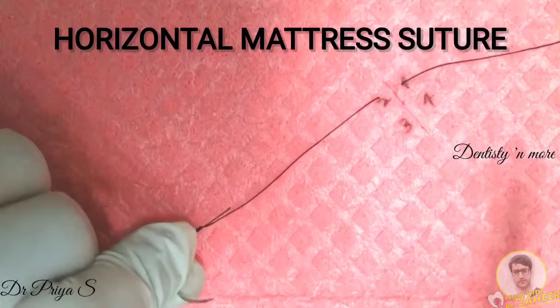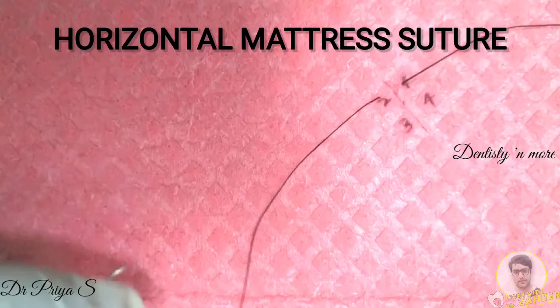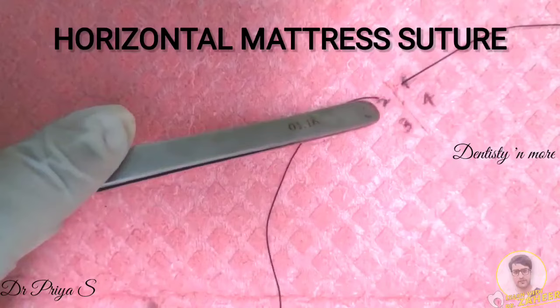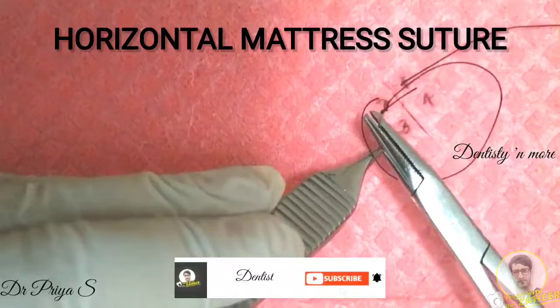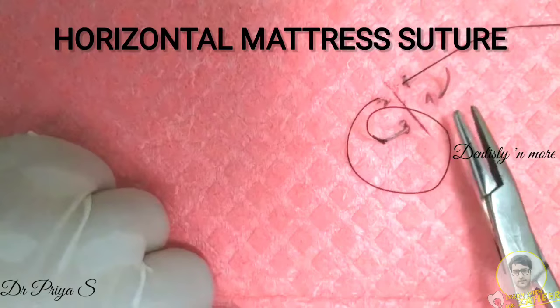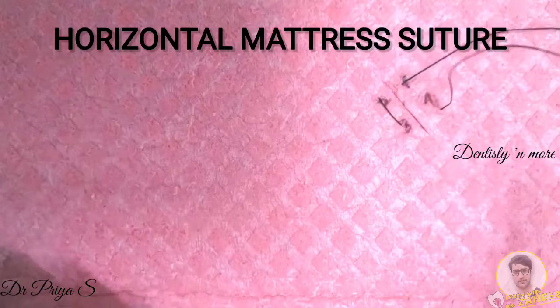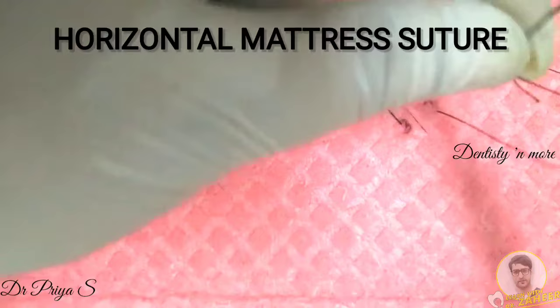You have a first entry point on one side of the wound and a first exit point on the opposite side of the wound. You then have the second entry point 1 cm away from the first exit point, marked as point 3. You enter the tissue again at the second entry point and then it exits the tissue on the other side at point 4 — the second exit point. So in total you have 4 piercings: 1, 2, 3, 4. The suture is then secured with a surgeon's knot.